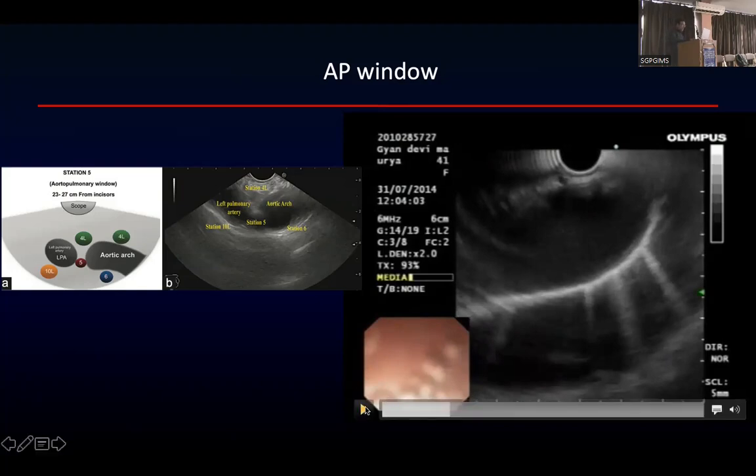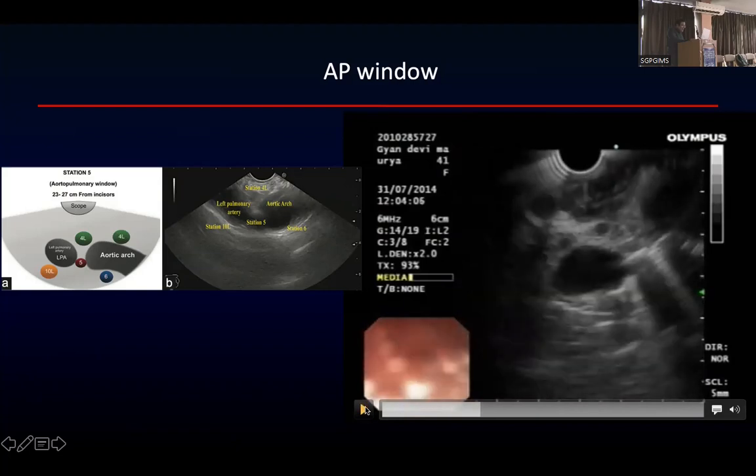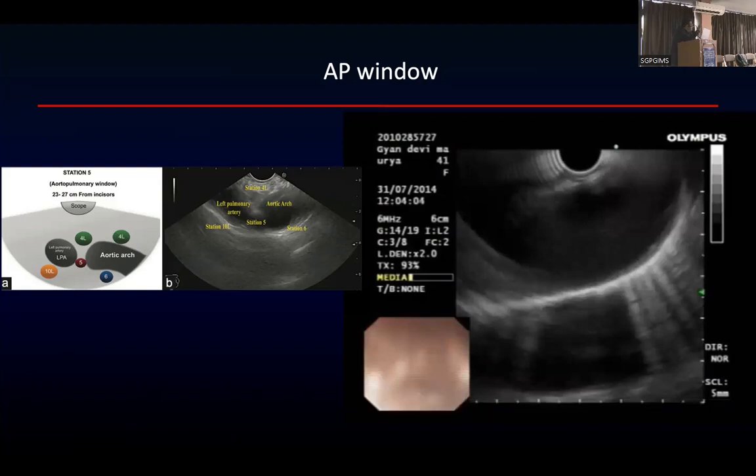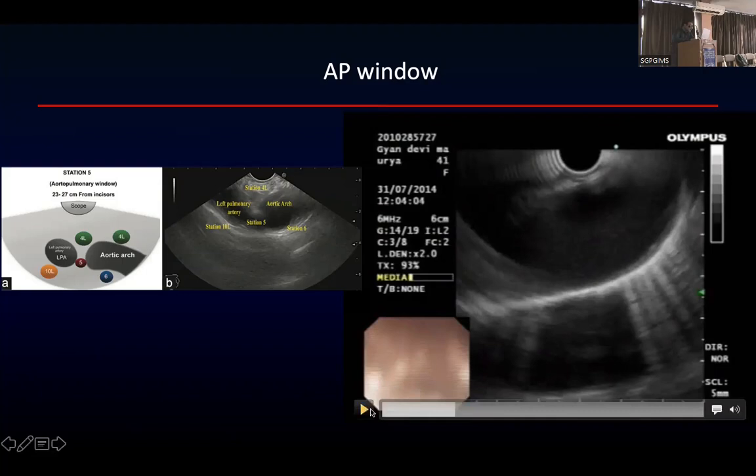So what you will do here is, once the aorta starts arching, advance the scope by 1 centimeter. Okay, rotate clockwise 60 degrees. Fine, this is the method of how to see the AP window. What do you do? See the aorta, trace the aorta to the aortic arch. Once you reach the aortic arch, push in a centimeter, rotate clockwise to around 60 degrees. What will you see?